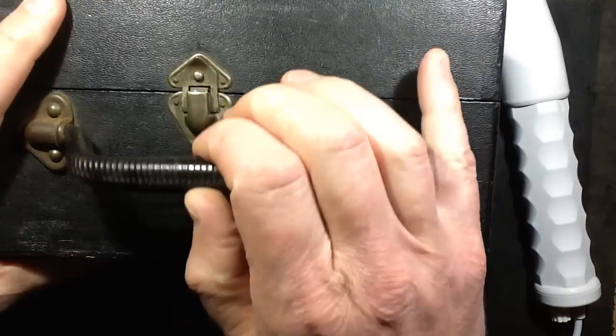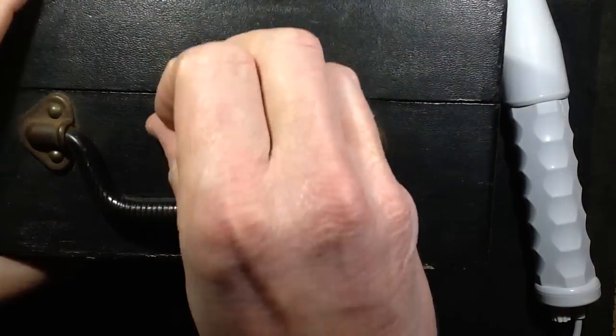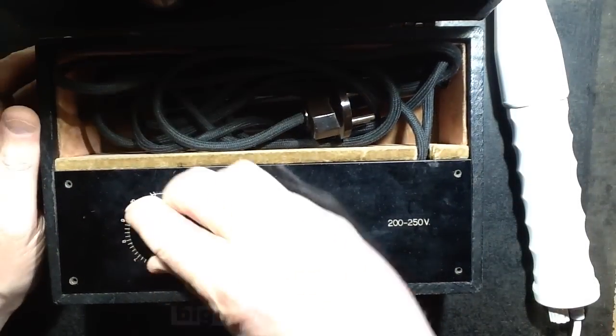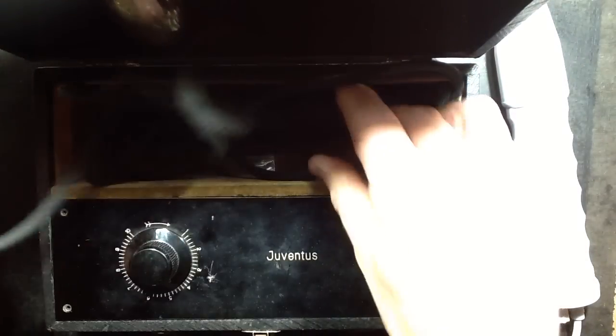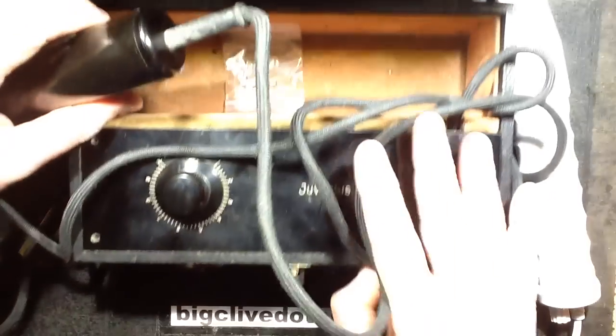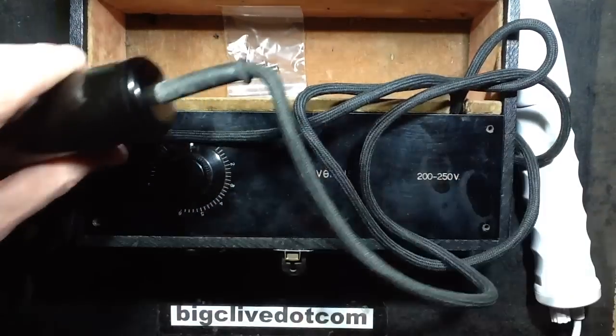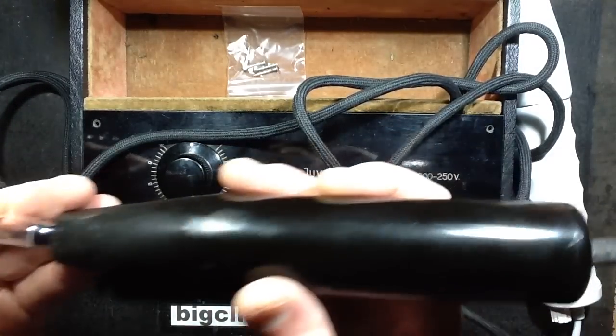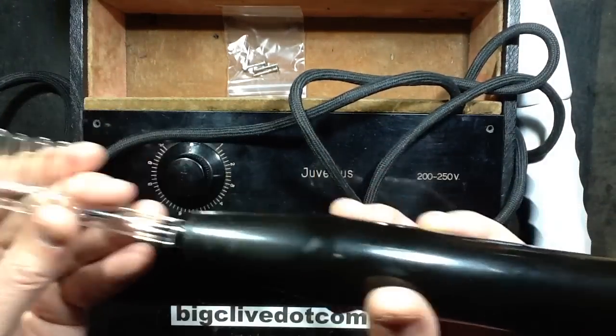This is how they used to be supplied in the bad old days, in lovely wooden boxes with lovely handles and brass catches. Inside, the electrodes would be in the lid, and you'd have the big control knob and then a dodgy two-pin plug and the actual head of the unit itself, which would be connected to all the electrics. The wand itself would be a separate thing on a cable like this.